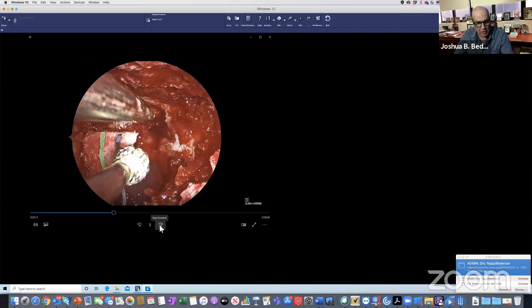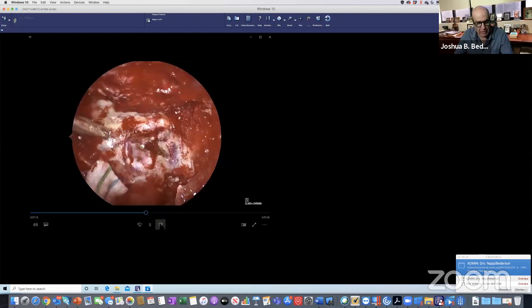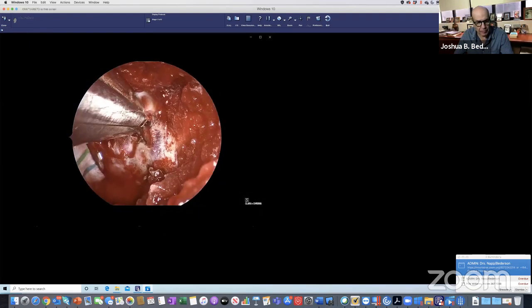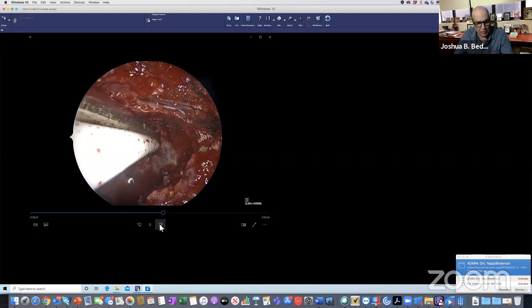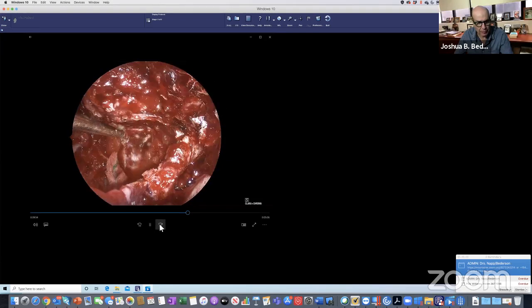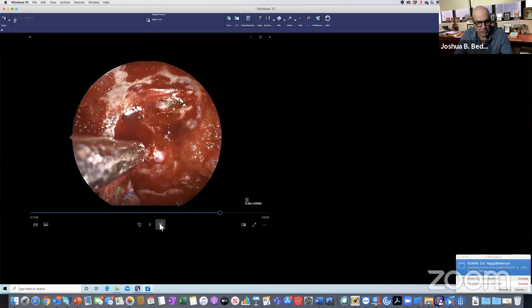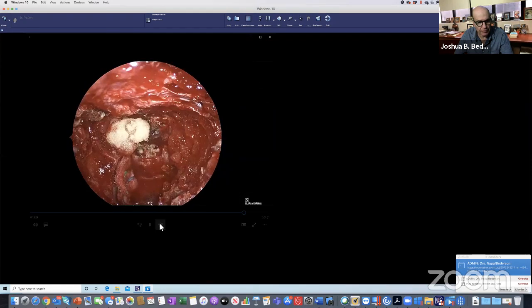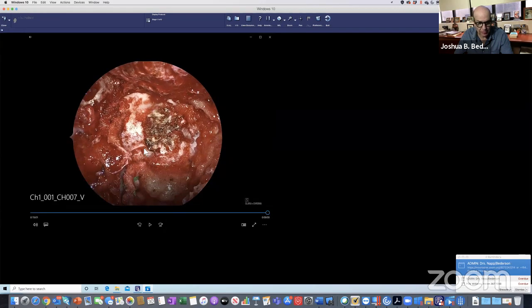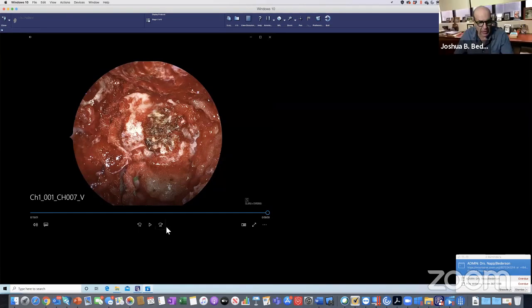And so in this particular surgery on Thursday, we've probably spent, I want to say, 45 minutes to an hour with this second part of the exposure after ENT's part. And then about 20 minutes removing the tumor. Is that right, Kurt? Okay, so this is more or less the exposure.